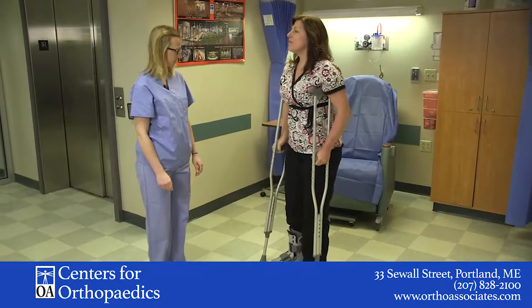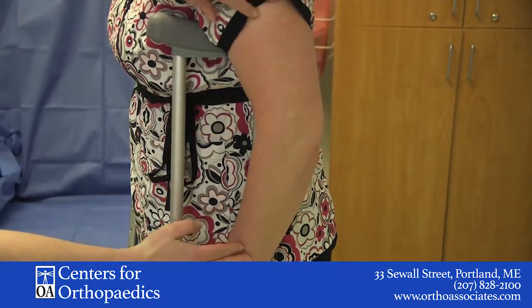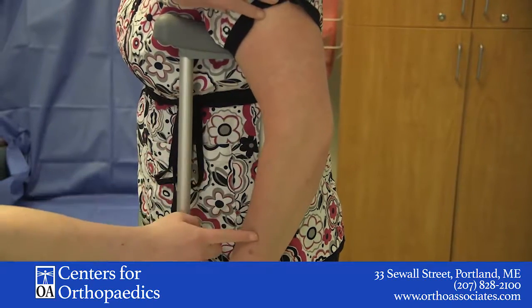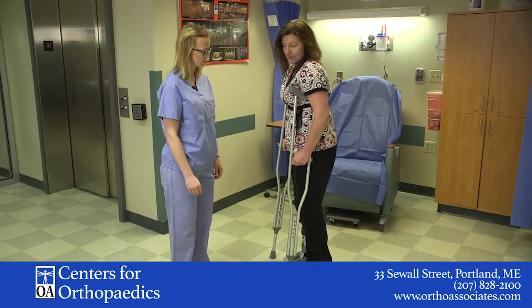So we're going to take a look at this again. We're going to look at Donna's elbows and she has a nice slight bend here. You want about 15 to 30 degrees of flexion in the elbow — anything less or more than that is going to be a little bit too much.